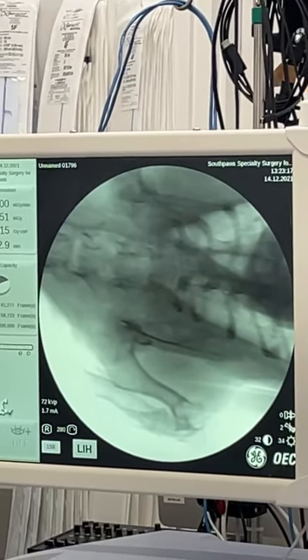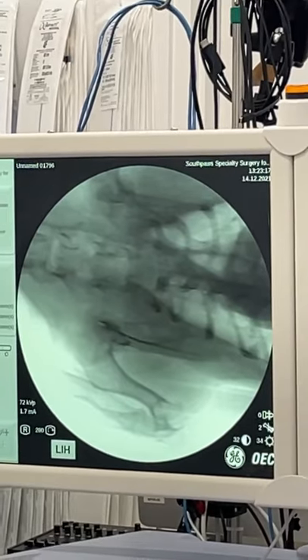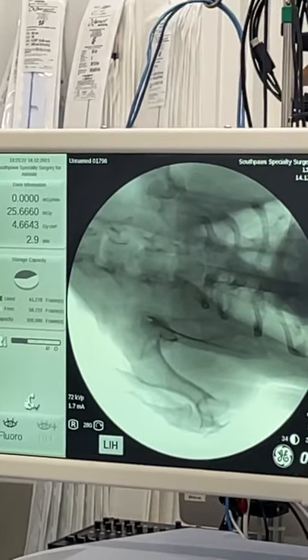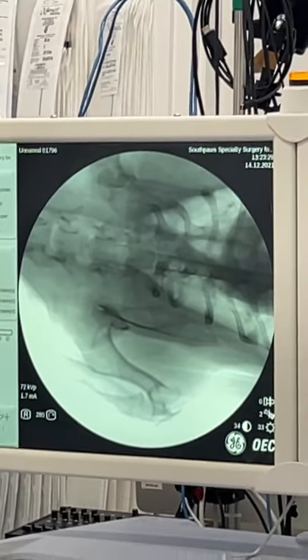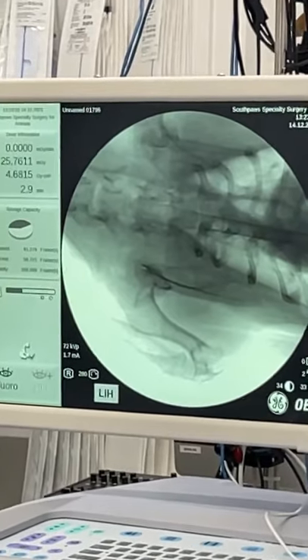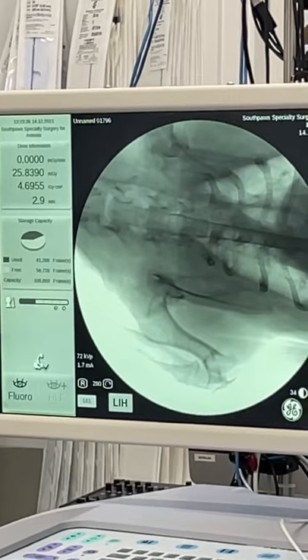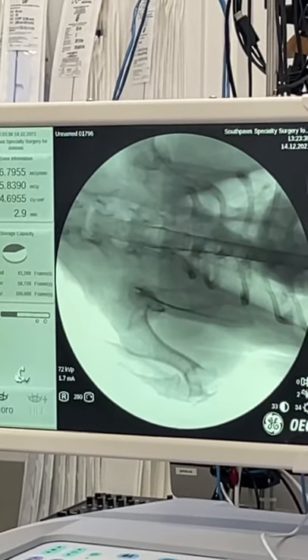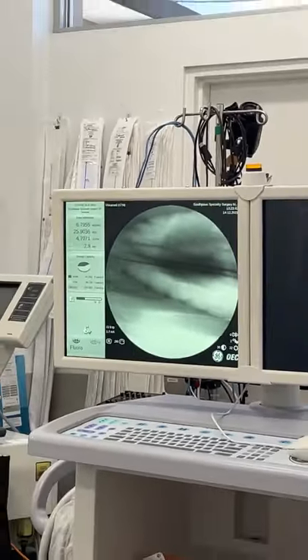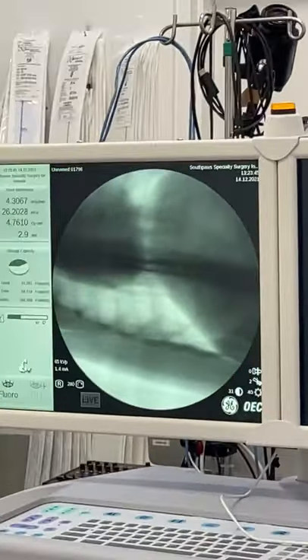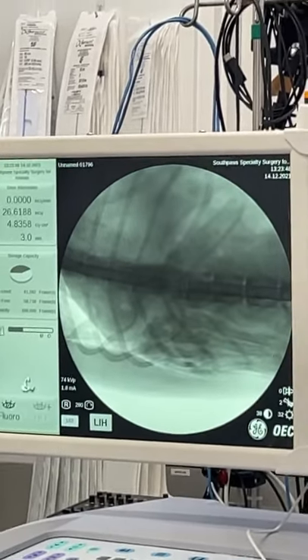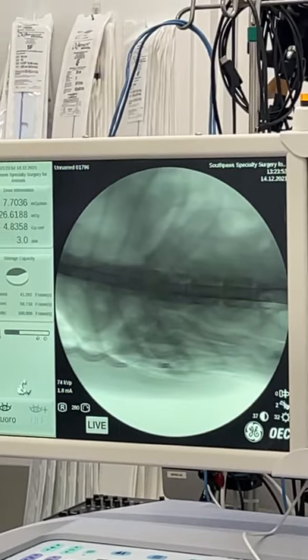Now we're up to about T1. Just continuing to inject and once I get to the mid-cervical region I'll be happy to stop. The reason I'm stopping there is, number one, I'm confident we don't have a cervical disc lesion. Number two, I don't want to get contrast up into the brain which would make it more likely that we're going to get a seizure. You can see that we've got a nice contrast column, and then when we get down to the caudal thoracic region we've got a little bit of a deficit right there, and then a nice contrast column.